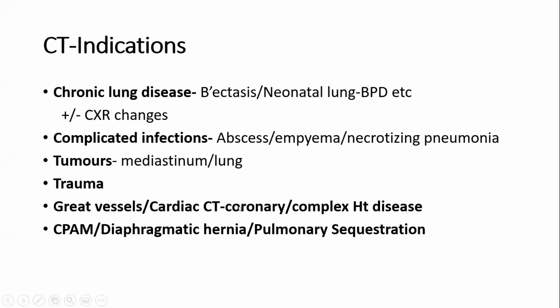Obviously, great vessels, cardiac CT, and complex heart diseases, you need a CT. More and more, we are trying to get into MRI for cardiac diseases. And in neonates, diaphragmatic hernias, pulmonary sequestrations, etc., you need assessment with the CT.